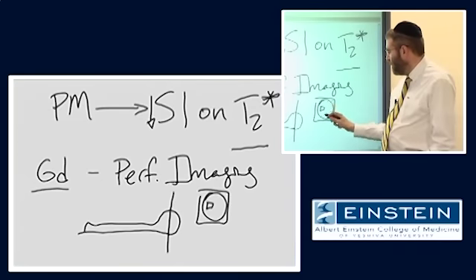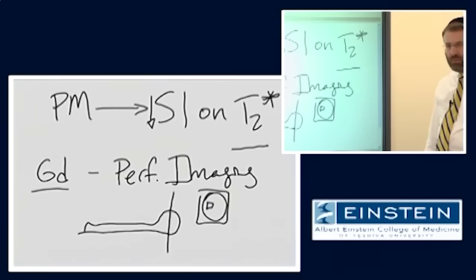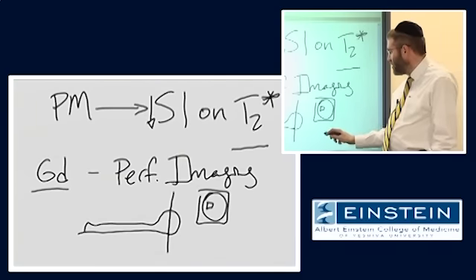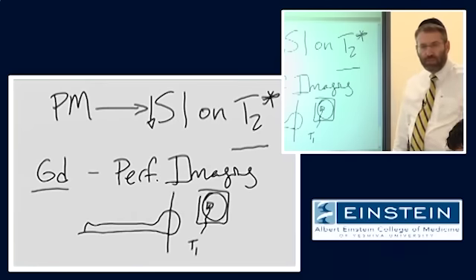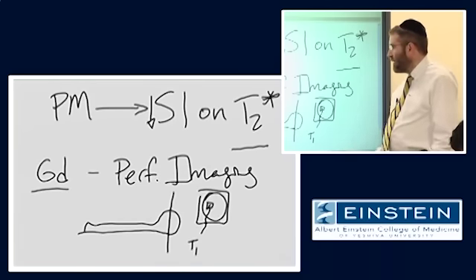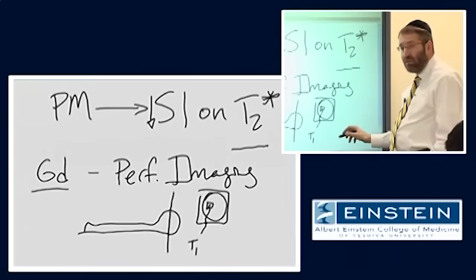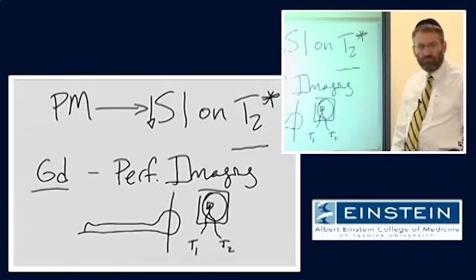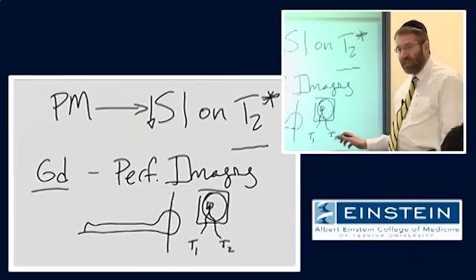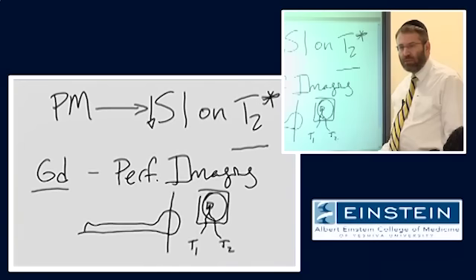If we acquire that image using whatever technique, gradient echo, spin echo, pick whatever you want, and we measure some amount of signal intensity at that location, some amount of transverse magnetization. Let's now give a contrast injection and do the same thing again. Acquire the same image and measure that signal intensity. So we now have 2 points in time. How is the signal amplitude acquired at that location going to differ between time 1 and time 2?